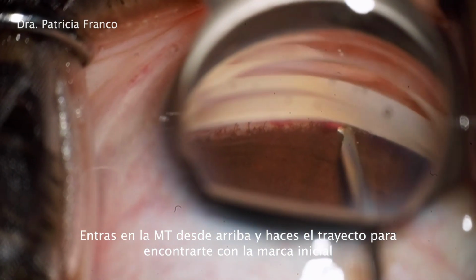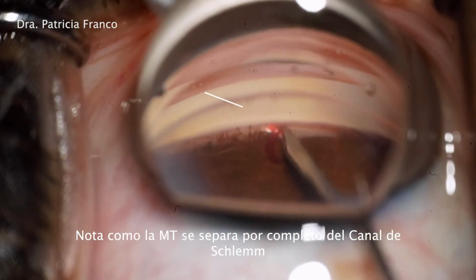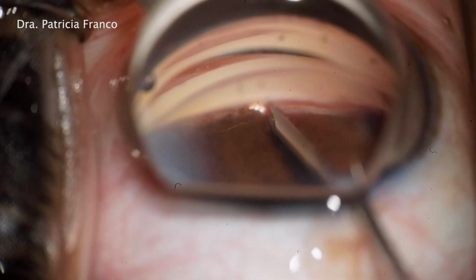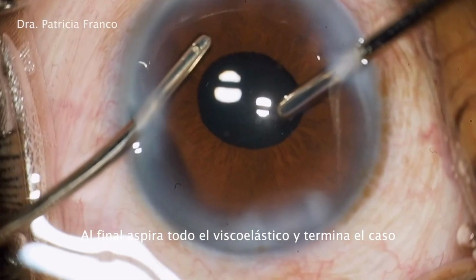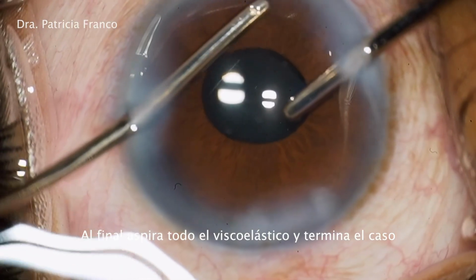See how the trabecular meshwork is excised until it meets the first mark. The trabecular meshwork is cut off completely from Schlemm's canal. At the end of the case, aspirate the viscoelastic very well and finish the case.